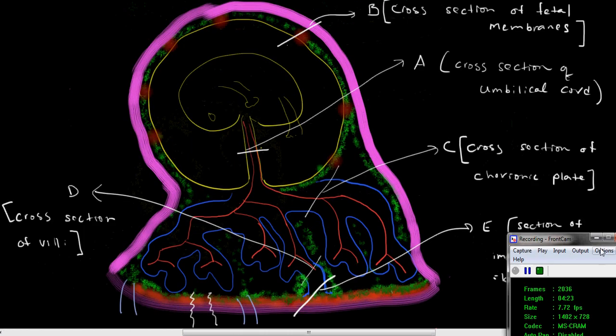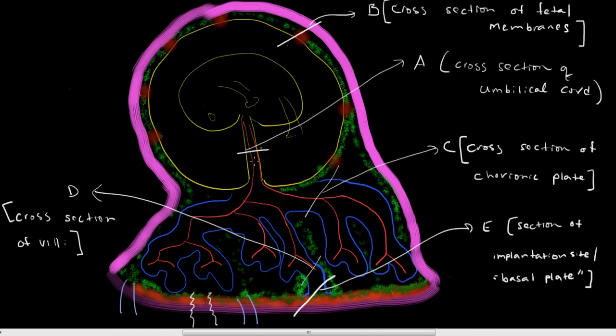As I'm dictating this video, I have a very bright student here, and she asked me morphologically what distinguishes, if you're looking at the slide, what helps distinguish a urachal remnant from a vitelline remnant.